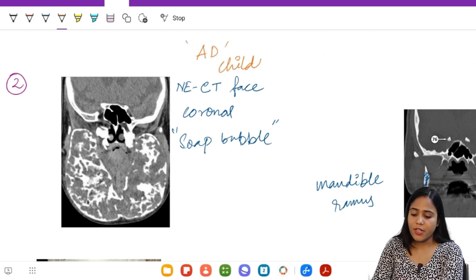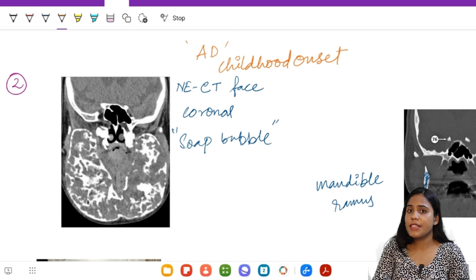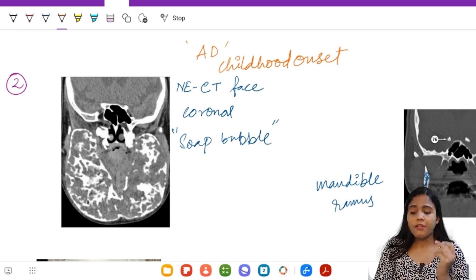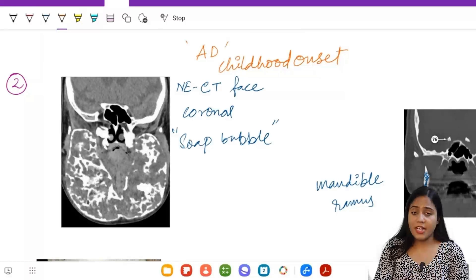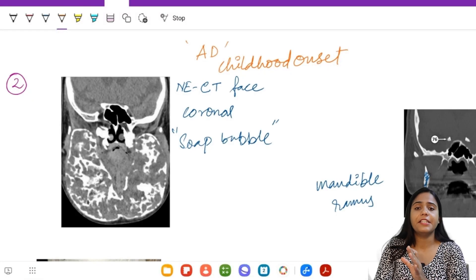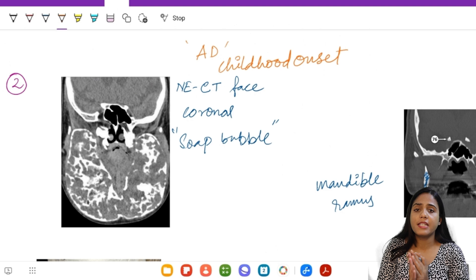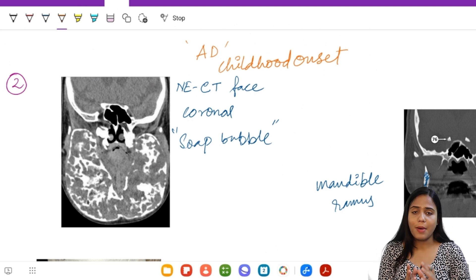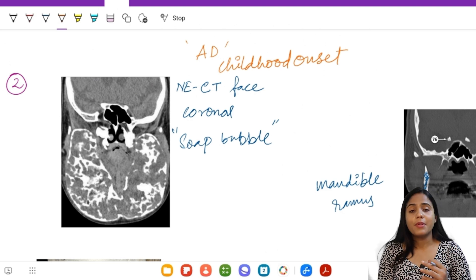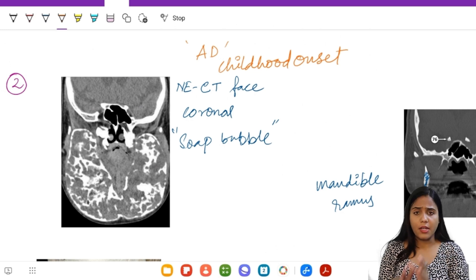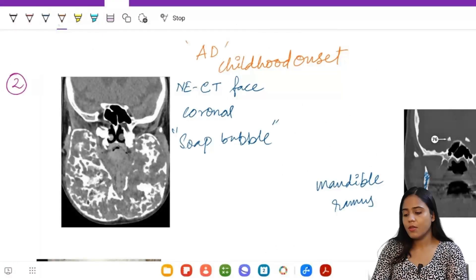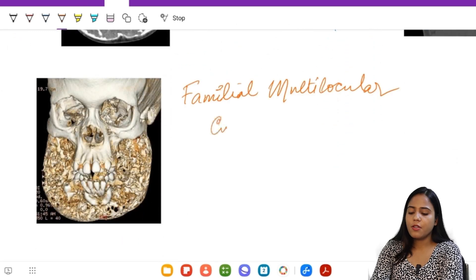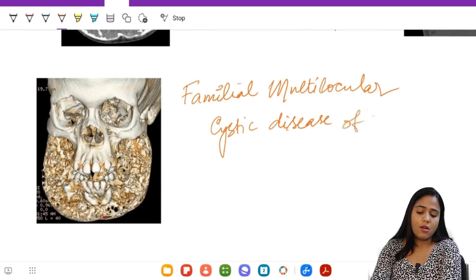Here are some hints: this is an inheritable condition with autosomal dominant inheritance and childhood onset. Importantly, these lesions were initially thought to be subtypes of craniofacial fibrous dysplasia, but now the genetic basis has been found to be completely different and they are considered separate entities. These findings are of childhood onset, but by the time the person becomes an adult, they sclerose and often regress.